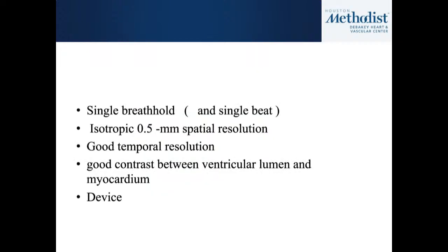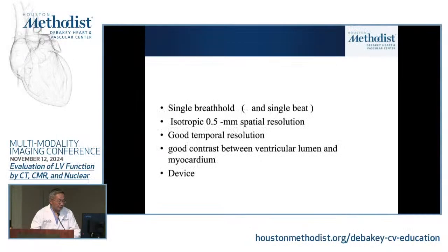All right, why is CT attractive? I mean, you all know, it takes less than 30 seconds to get a study done, right? Single breath hold is very easy on the patient. Because of radiation and contrast, we'll probably not be doing this in every single patient, but it's so easy, right? And the spatial resolution is the best, and reasonable temporal resolution. With a heart rate more than 70 or 80, I'm not so sure, but it'll tell you if it's normal or abnormal.